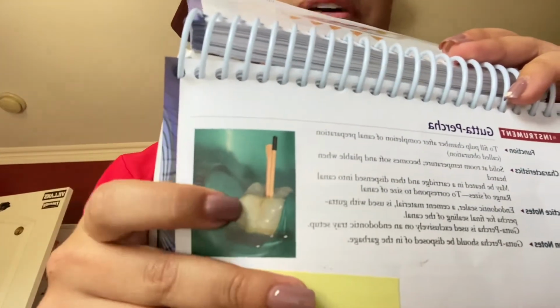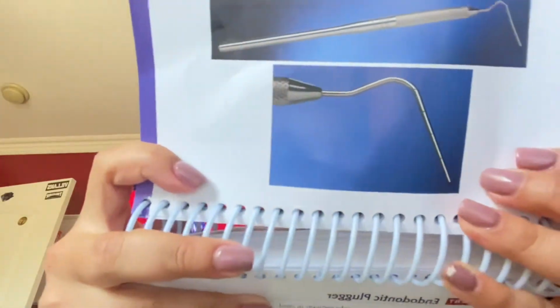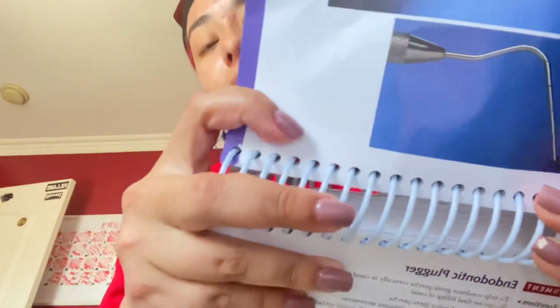And then when the Glick is all nice and heated up, we're going to start condensing the gutta percha. I'm going to show you again what the gutta percha looks like. This is it, and then this is it inside of the tooth, not yet heated and then kind of scooped away. The plugger or regular condenser can be used to condense the gutta percha into the canal. It has kind of a flat tip, so it helps really condense it in there.